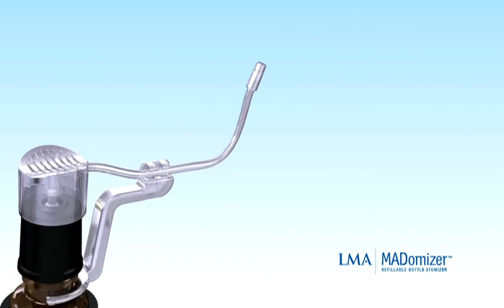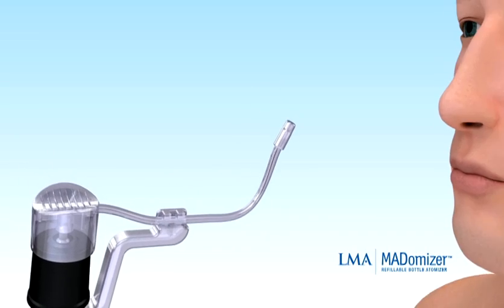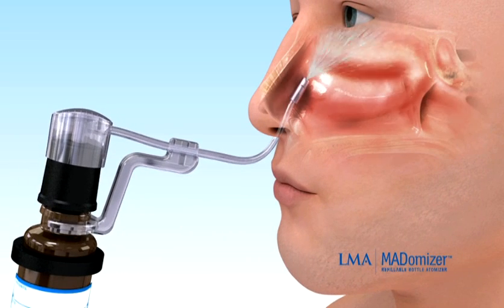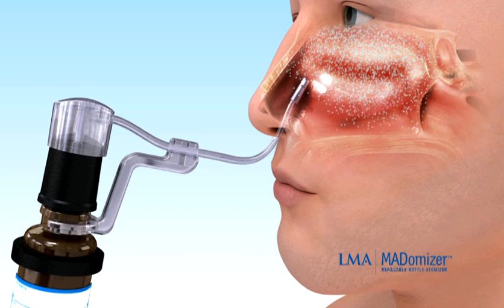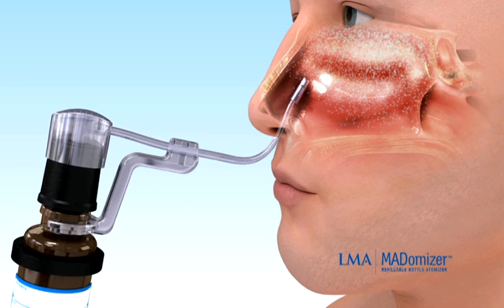Place the applicator tip into the patient's nostril or oropharyngeal cavity and compress the pump to spray solution onto the patient's mucosa. Repeatedly compress until an adequate volume has been delivered.